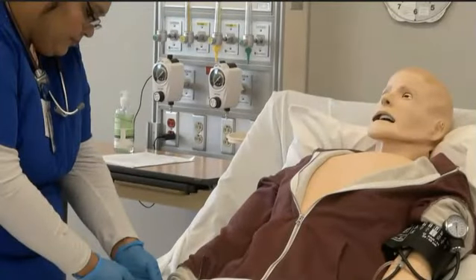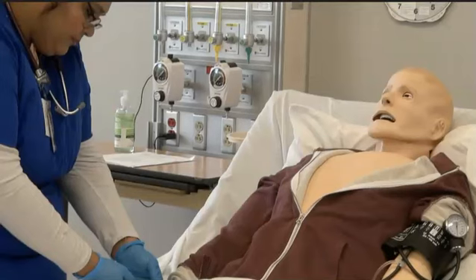As you noticed, as she approached the patient, she asked for permission to enter the room and greeted. Once the patient provided permission to enter the room, she introduced herself, let the patient know she was their respiratory therapist, and identified the patient using two patient identifiers. The first part of the two-part patient identifier is asking the patient to state their full name and date of birth. Once they have stated it, they will be compared to what is stated on the armband. This ensures the correct patient.